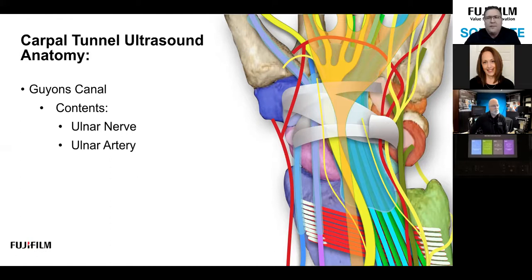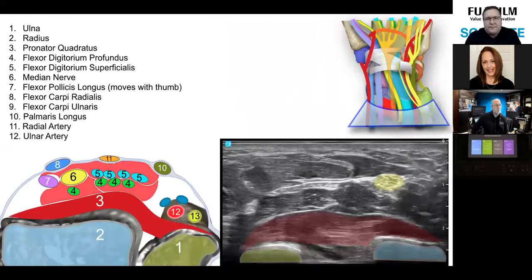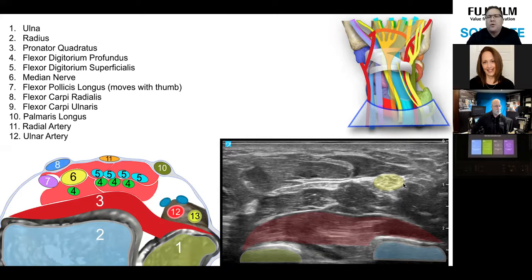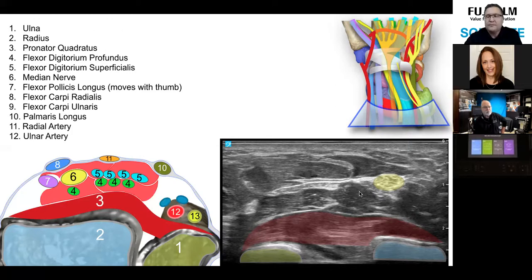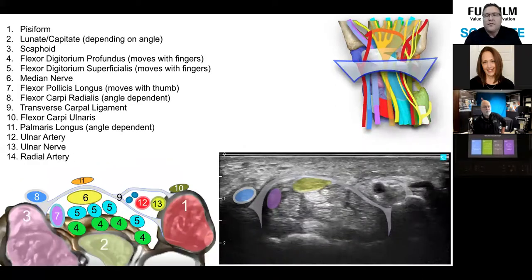Switching over to cross-section: here's a reference showing where the transducer is located. We start at the pronator quadratus layer — this is where the median nerve sits right over the radius at this interosseous membrane level, with all the flexor groups before they really bunch together. We'll then travel distally just a little further to the inlet of the carpal tunnel.